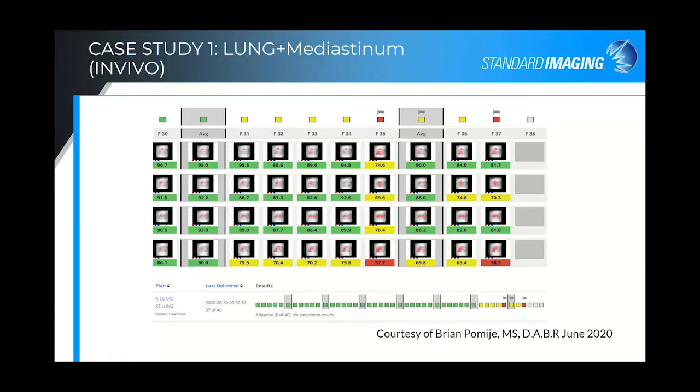One can see from the dashboard chiclets showing the passing gamma criteria when compared for both the reference fraction and the predicted image. One can see in the beginning, up until fraction 31, that daily alerts did not occur for this particular patient. And then starting along about fraction 31, several daily alerts occurred, followed by a failure.